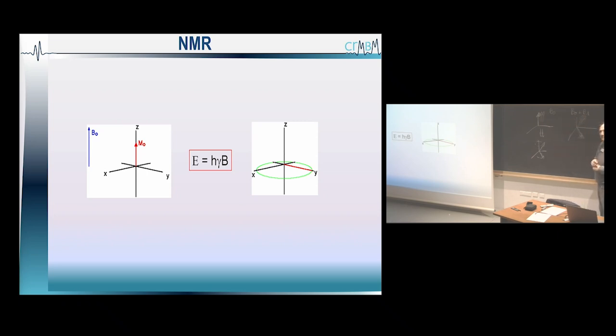Okay? Then, the sum you did before, which was not 0, because you have more in here than in here, if you do the sum on this axis, it'll go to 0. But now, if you do the projection in here, it won't be 0. It was 0 before, but it's not going to be 0 here. This is a little bit tricky, because actually I'm not saying all the things.